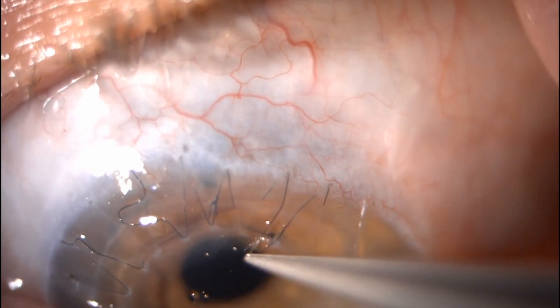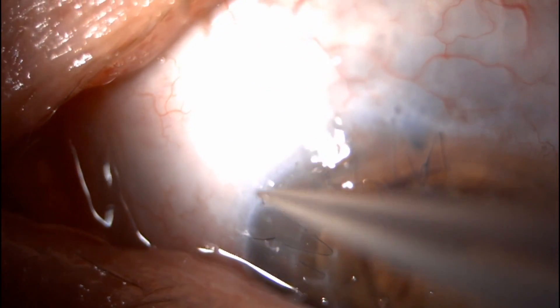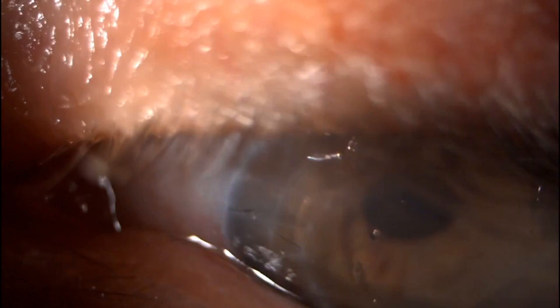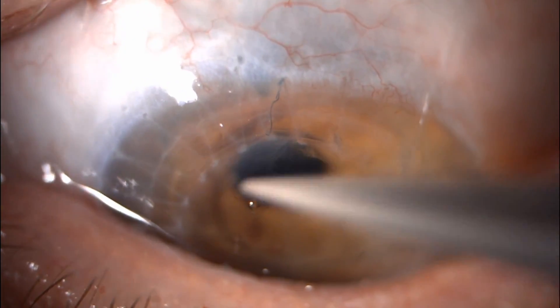We're almost done with this patient. We've got one more section to remove and then we'll have to deal with the area where the knot is. The knots on these are typically at 12 o'clock and you don't want to pull the knot through the graft-host junction — that's true whether it's a running or an interrupted suture, for fear of opening the graft-host junction. Using that same technique we learned, we'll grab the suture and quickly pull it out. And even though the suture broke, we'll consider it gone.